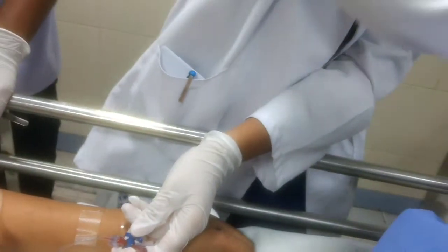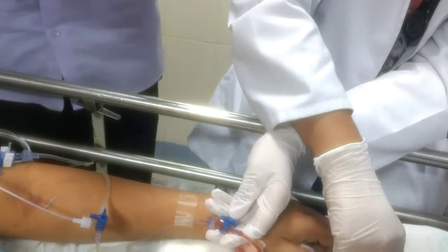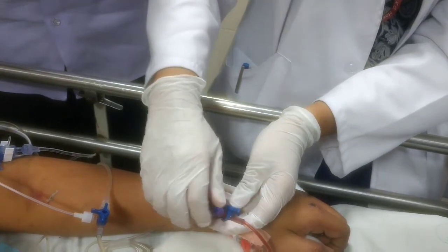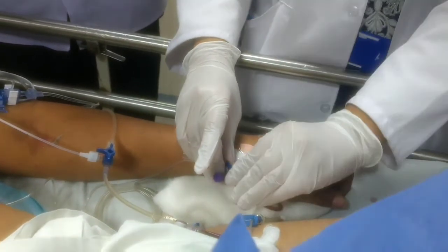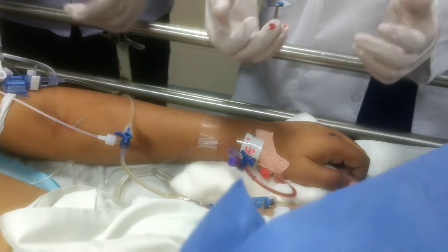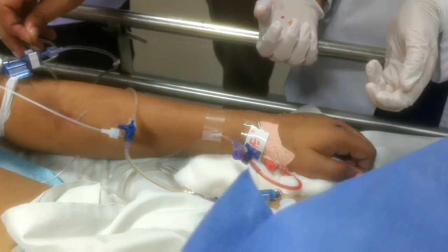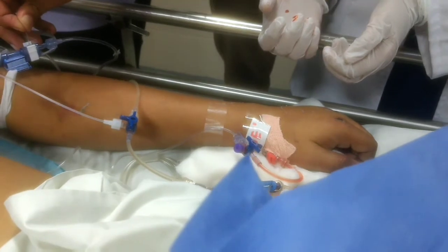Once you have collected the ABG sample, our apnea test comes to an end. As soon as you have collected the ABG, we have to connect the patient again to ventilatory support. Flush the arterial line, then connect the patient to the ventilatory support.